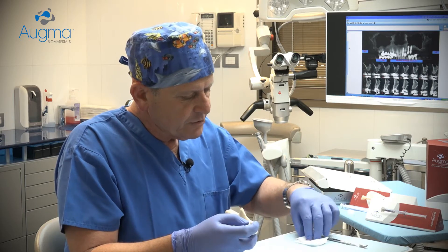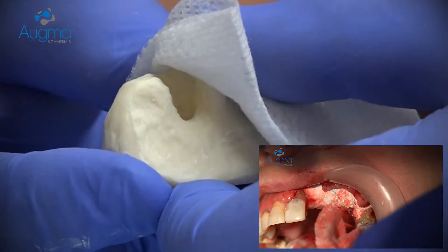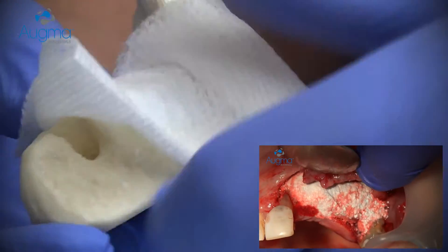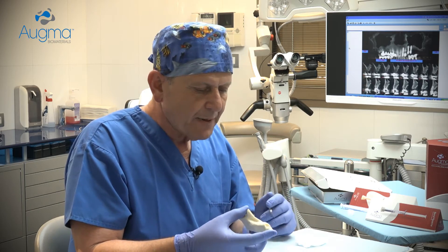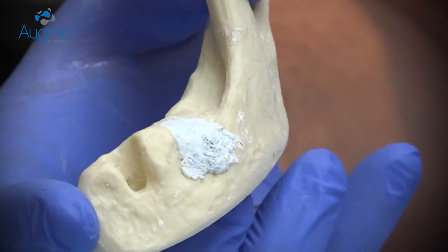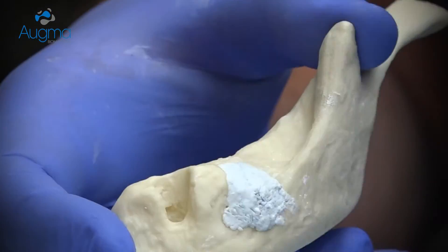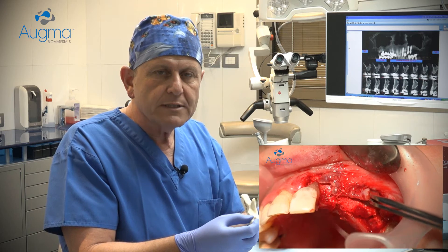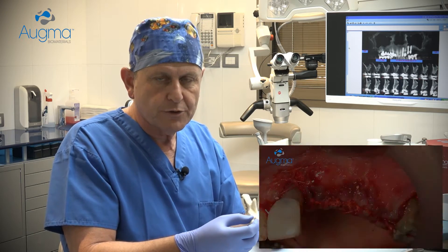At this stage, you should take a dry gauze, place it above the cement, and press it firmly for three seconds. Now the material is already well stabilized. If you need to shape it, you can shape it a little bit and press it again for three seconds, and then you can close the flap. However, it's very important that your soft tissue is primarily closed and well sutured.